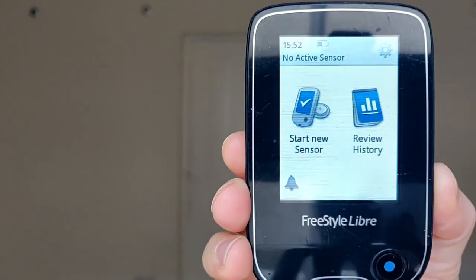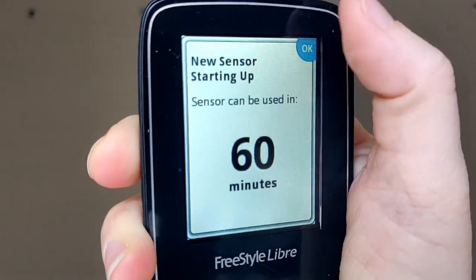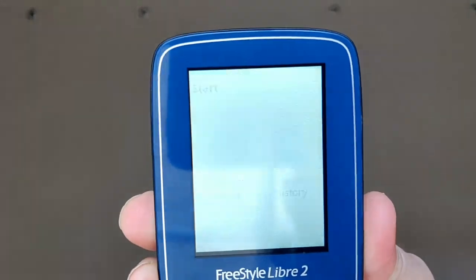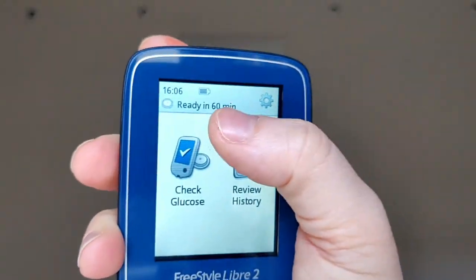To activate both using the readers: for Freestyle Libre 1, you turn it on, select 'start a new sensor', tap it against the sensor, and it says 'sensor starting up, can be used in 60 minutes'. Same process for Freestyle Libre 2 — start a new sensor, tap it off the arm, and you get the same message: sensor ready in 60 minutes. Both are now activated; we'll leave it 60 minutes and then take the first blood sugar reading.